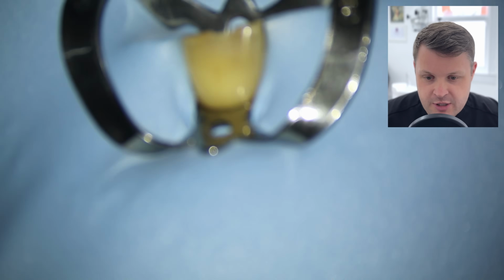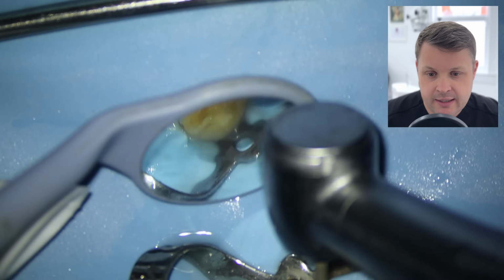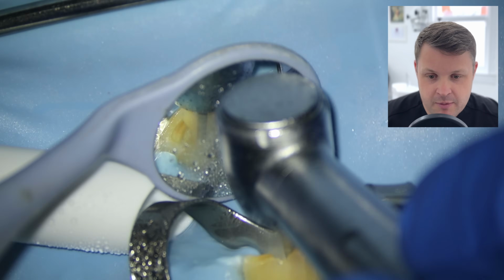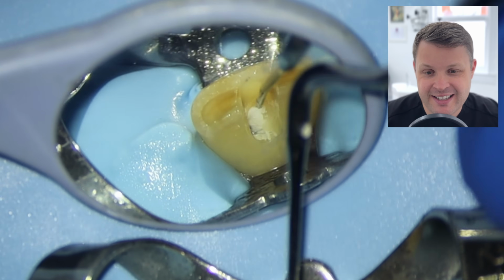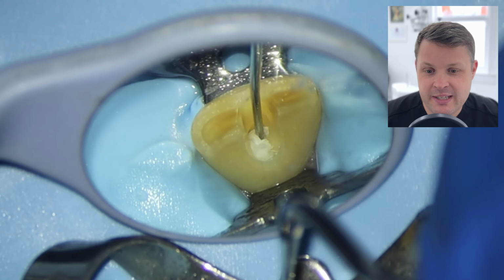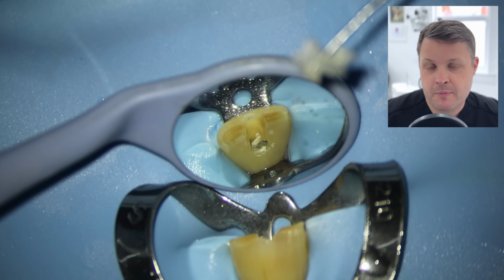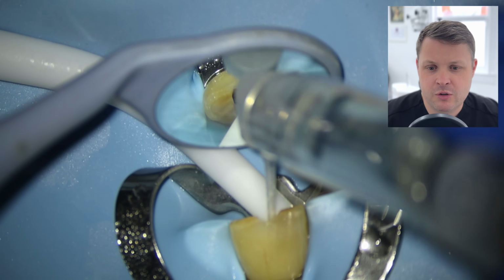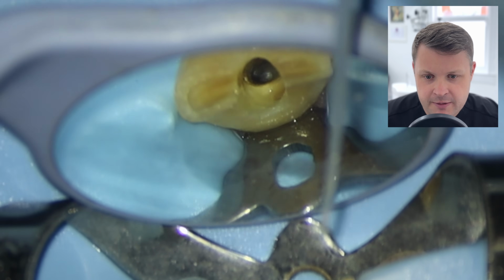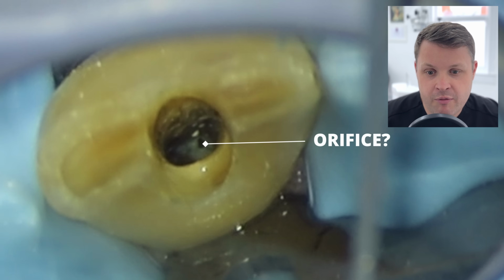So in the first instance, I want to remove all the obvious temporary filling material. I'm going to remove the PTFE, but in this case, it's a bit difficult to remove, mainly because there's a bit of an overhang there. It's a bit of a catch-22 with these overhangs, because sometimes you can remove too much tooth tissue. But once we've removed the PTFE tape, I give it a good clean out. And when I have a look at the tooth itself, I can see straight away that there might be some kind of obvious orifice, and I have gone to palatal.